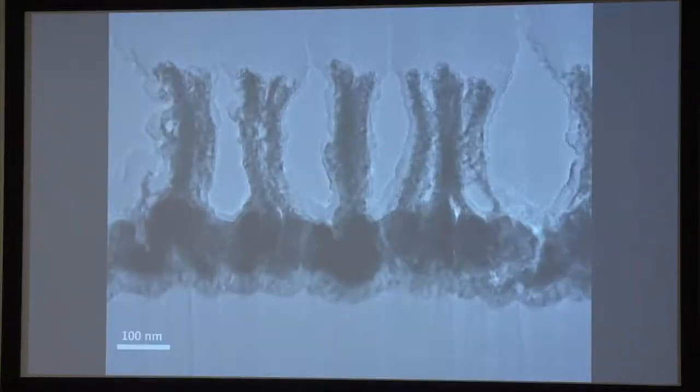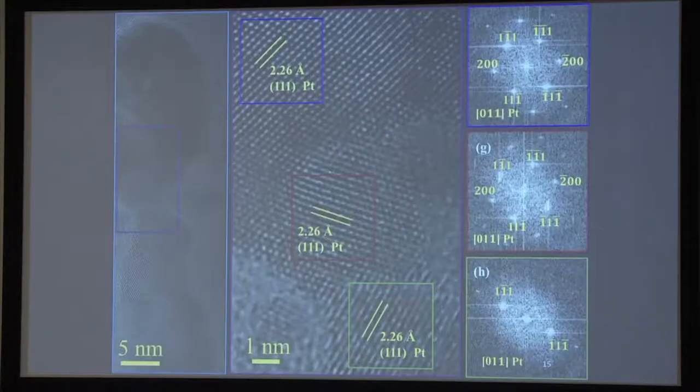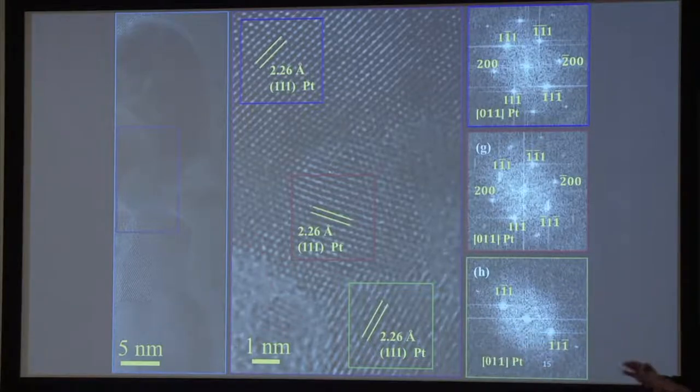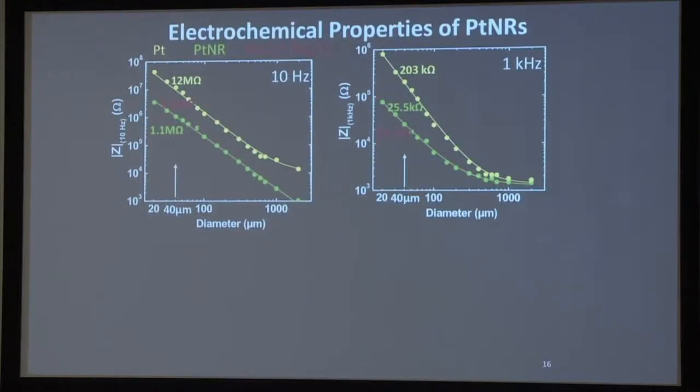Now, if you look a little bit closer in the transmission electron microscope, we see that these devices are built on parylene with a thin adhesion layer, a platinum base, and the rods themselves are porous so that you have a slightly larger surface area to volume ratio. And if we look even closer, we see that there are a lot of these sharp facets, and these facets induce charged dipoles that usually lower the work function and enhance the electrochemical activity. So it's not only a gain in the surface area, but it's also a gain in the electrochemical interaction itself.